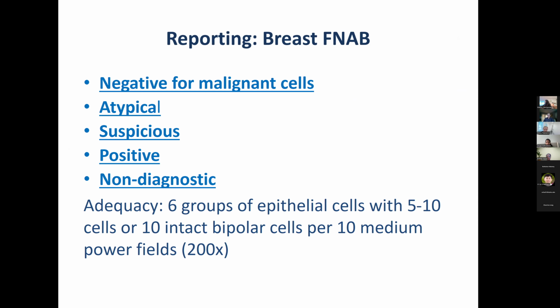And for example, invasive lobular, well-differentiated ductal cancers, it's not very easy for you to actually give that interpretation as positive. So limitations are there. And for positive, of course, you should be very, very certain something on cytology is positive to call it positive. And of course, there are specimens that you can go outright and call it positive.